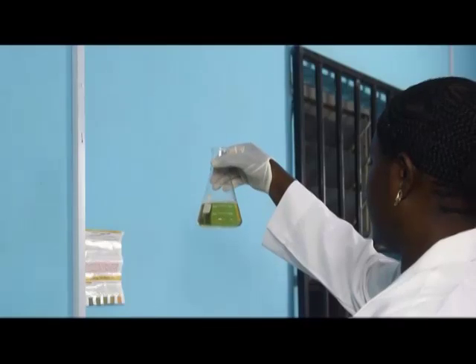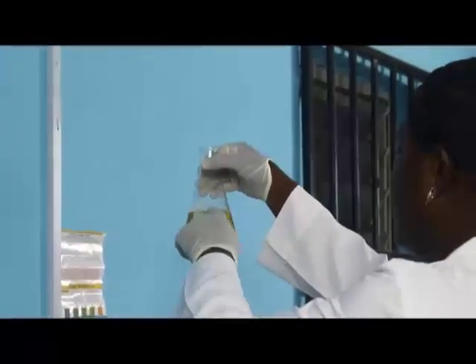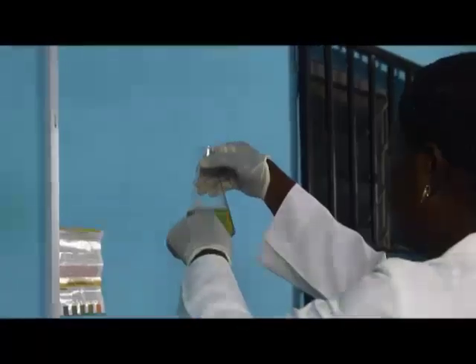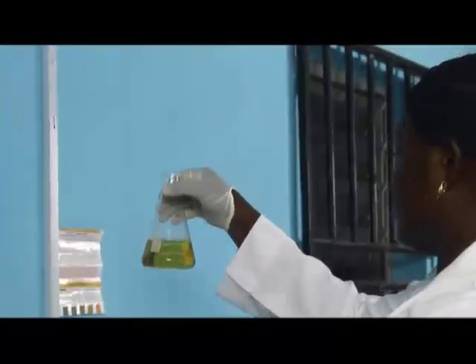Obvious abnormality in the color and appearance may suggest possibility of bacterial infection, as in cloudy urine; dehydration, dark-colored urine; hematuria, red-colored urine; liver disease, tea-colored urine.